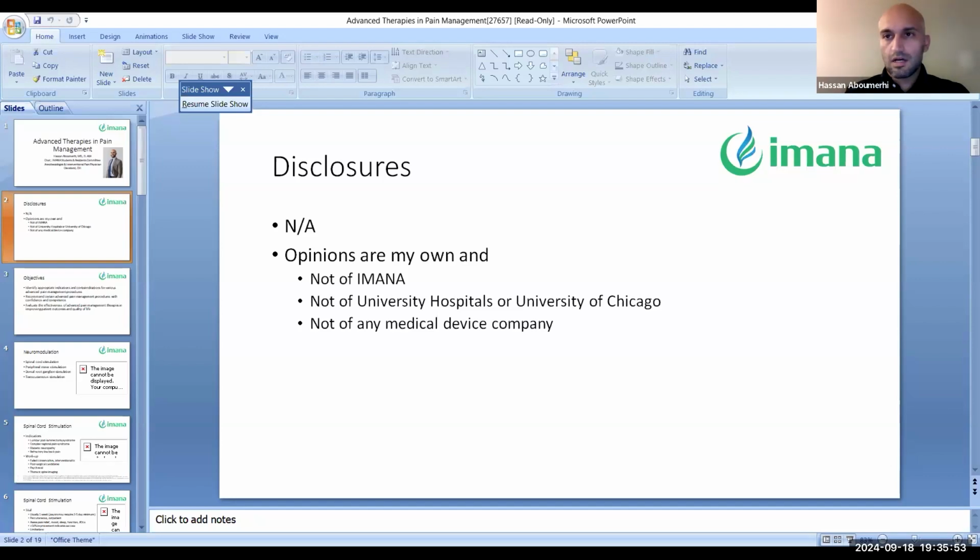But the most common, or at least the FDA-approved indications, are lumbar post-laminectomy syndrome, complex regional pain syndrome, diabetic neuropathy, and refractory low back pain. Off the bat, you can see that these are pain syndromes that are quite challenging to treat. A lot of these patients have already been through the ringer when it comes to conservative treatment. A lot of them have already had surgery, or perhaps they're not candidates for surgery. And again, that's the theme for a lot of these advanced procedures.